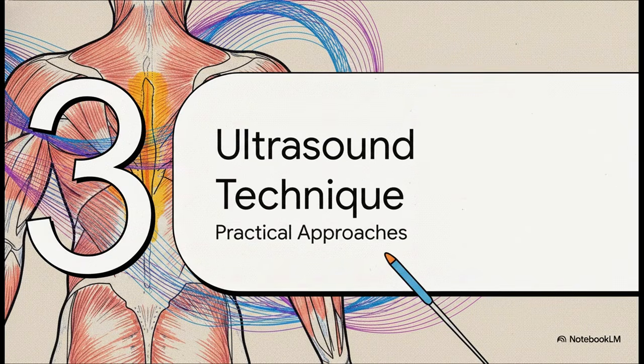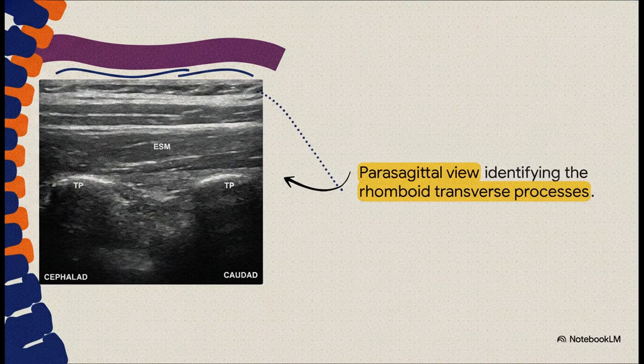Section 3. Ultrasound Guidance and Technique. Practical Approaches to the ESPB. Let's translate all these complex anatomical mechanisms into practical, ultrasound-guided technical execution.